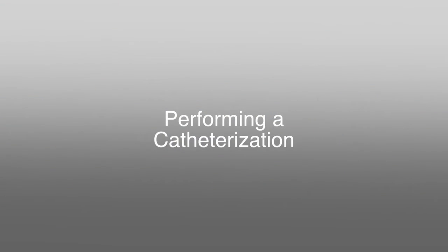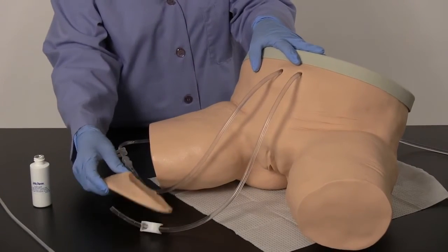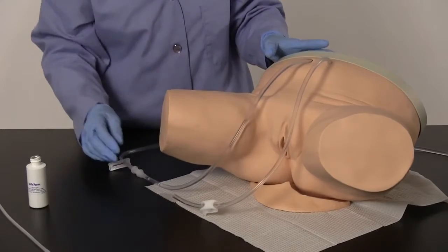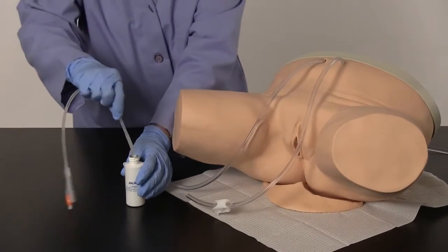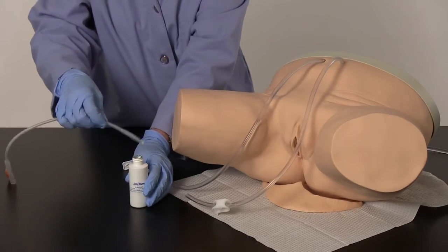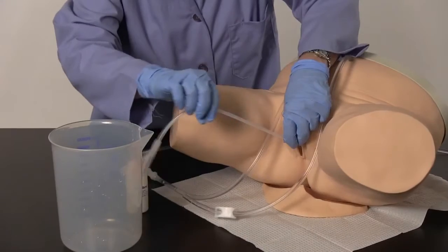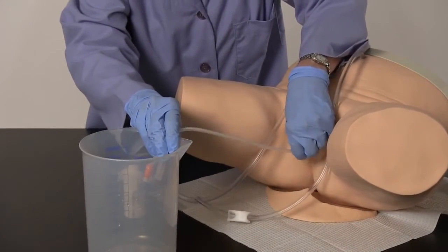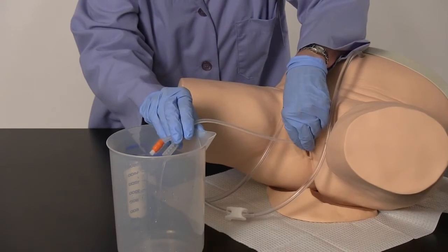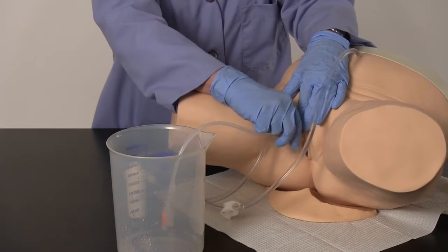Performing a Catheterization. Retain a water-safe container or a catheter bag for this procedure. Position the simulator using the supplied plastic pad. Generously lubricate the supplied 16 French silicone Foley catheter. Slowly insert the lubricated catheter into the urethra and through the simulated sphincter. With experience, you will feel a pop as the catheter passes into the simulated bladder. Continue inserting until the water flows from the catheter. Gently remove the catheter following each catheterization.